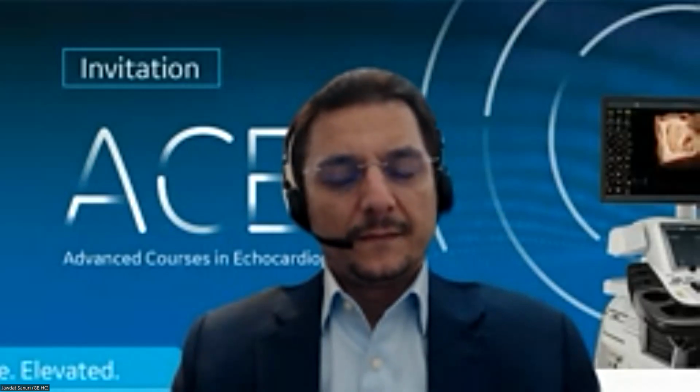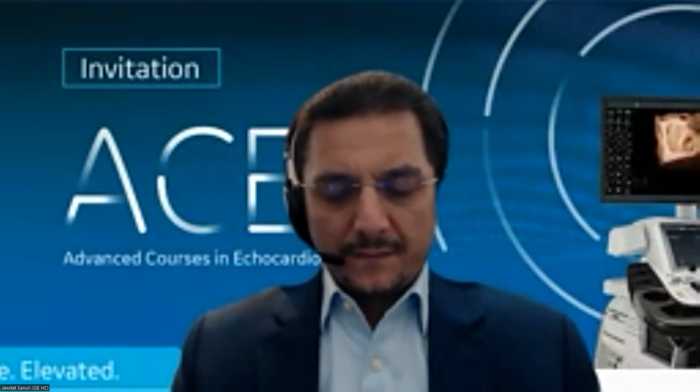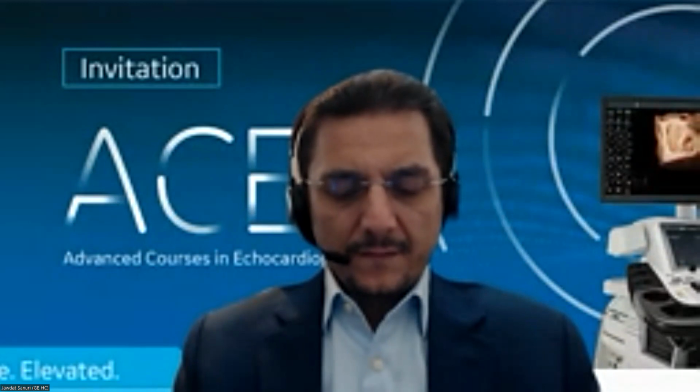As you talk about stress echo, all GE machines have coronary flow reserve, which is a very nice tool to Doppler the coronary, especially the LAD. If you are doing the stress echo and you can Doppler the LAD, the flow at rest and at the peak, you might get a lot of information. There is a tool called CFR on all GE machines, and there is a preset in all the machines.